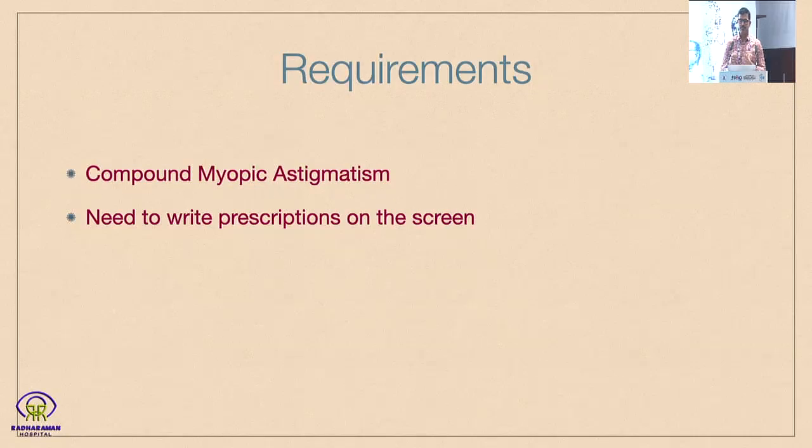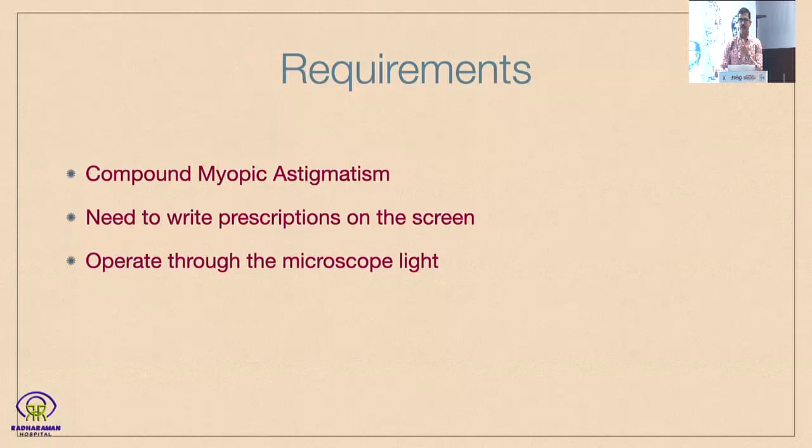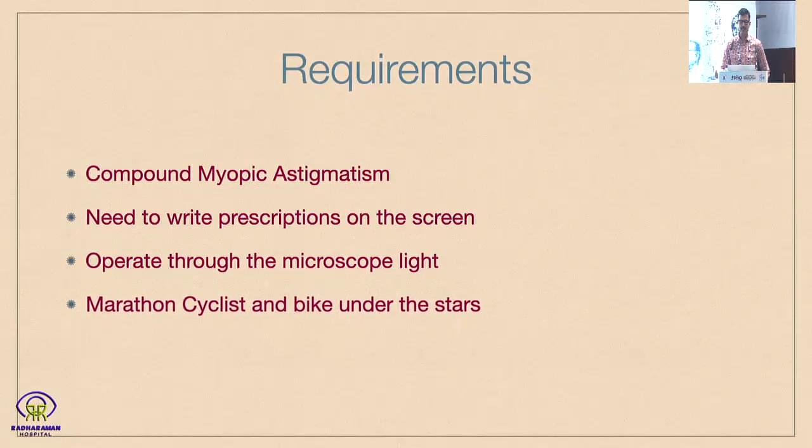I do need to write prescriptions on the screen. I use an EMR to see my patients and write down the findings on the screen. I operate through the microscope light, and every surgical microscope that throws a large amount of coaxial light, some amount of that actually reflects back to the surgeon's eye. So I do not want any glare from reflections through the microscope eyepiece.